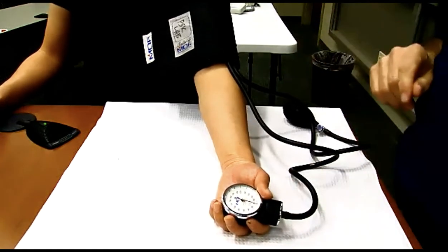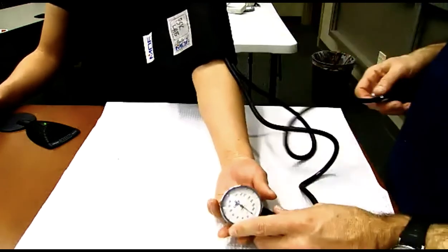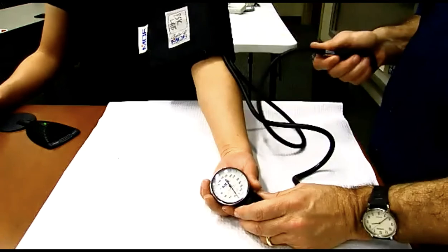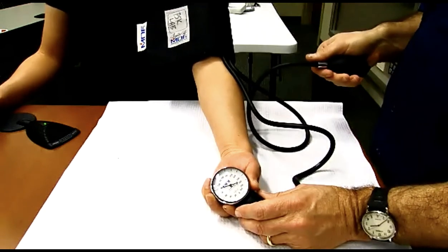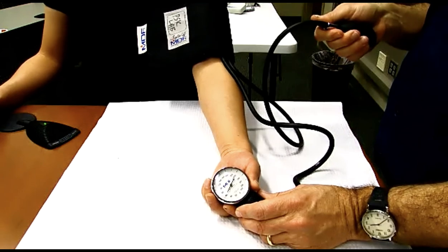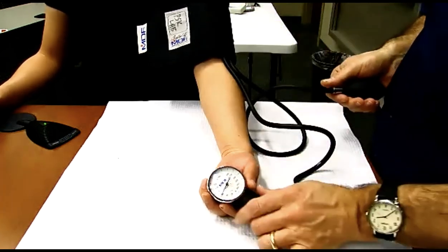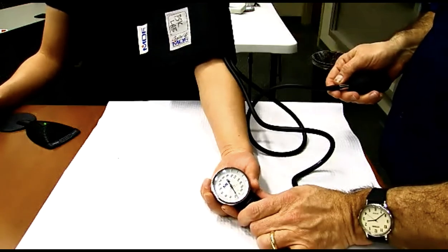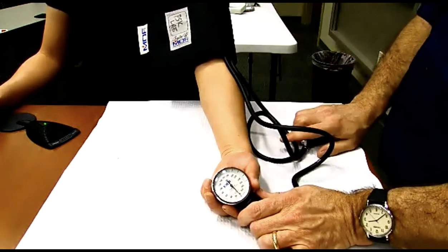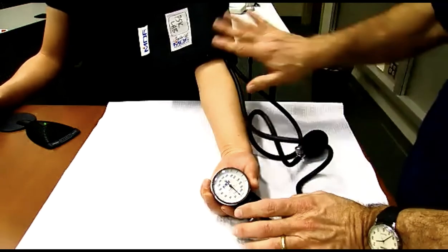So the last step on it is to inform the patient. Now here's the deal. This is always what happens: you've got your patient there and you're doing this thing and you're taking the reading and it's coming down and okay, there is the diastolic right there. And then you leave it right there, but there's still pressure in the cuff. So remember, when you get your reading, let all of the pressure out of the cuff. It's uncomfortable for the patient. So remember, when you're done with the reading, let all of the pressure out and let it go.